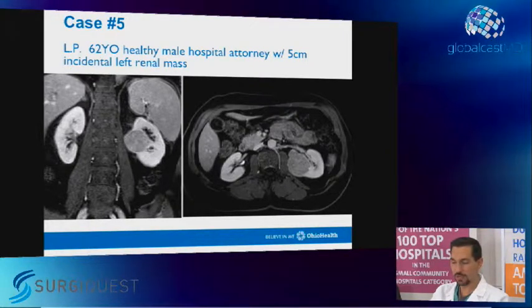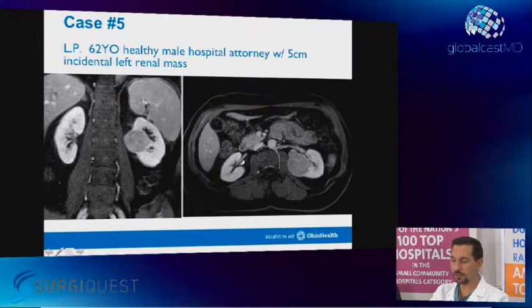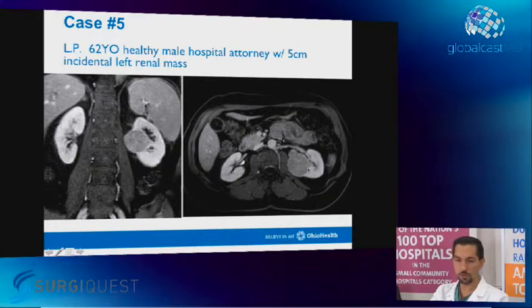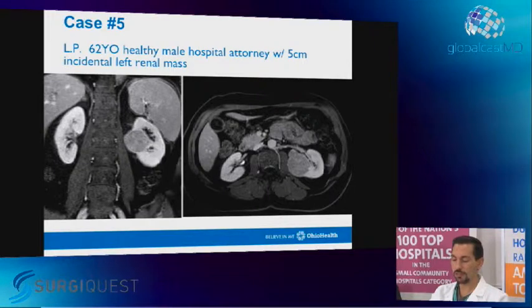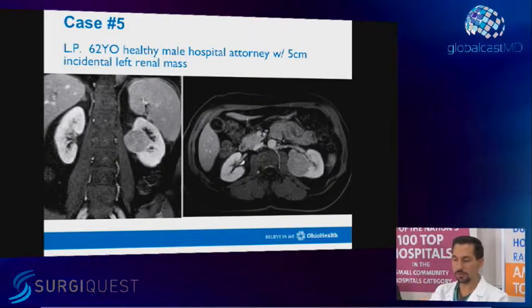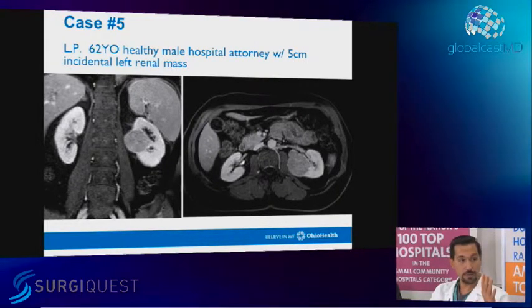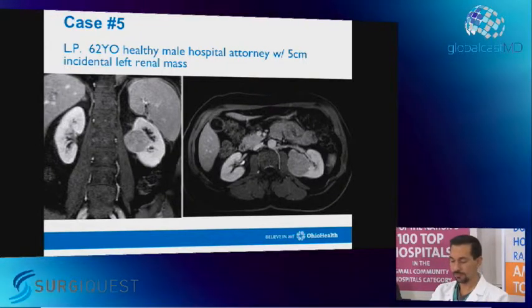So yeah, I think that's a key factor for these hilar tumors, is to try to get that plane as well as you can. At the very, very least, you have to get between the vessels and the tumor. You can't clamp and then try to do that part. Right. You know, get that done beforehand. It's an avascular plane. Sometimes there's little tiny branches of the vein that are coming off, and you can just bipolar those and take them. Well, sometimes you'll see an artery branch going to it as well, which you can get beforehand. You know it's going right to the tumor. You can just clip that, and you've helped yourself a lot by doing that.